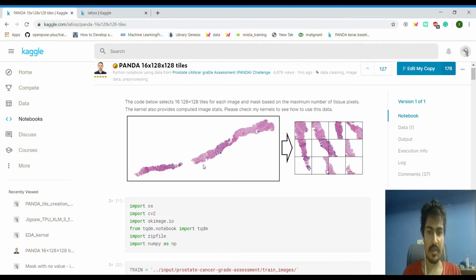And yes, it is. Since most of these images are occupied with white, or I would say background, white or black, it doesn't matter, the main interesting feature is not very visible to the model that we trained, right?